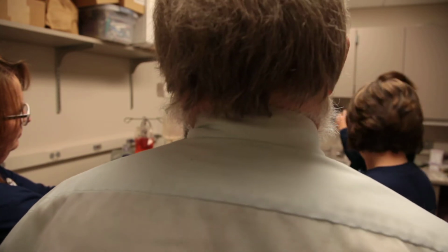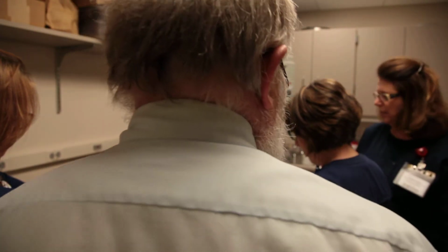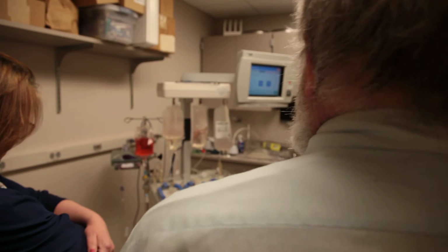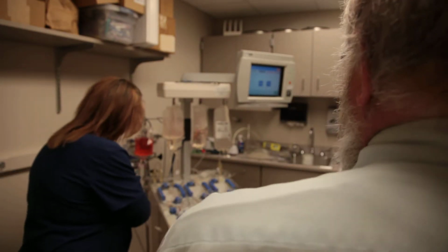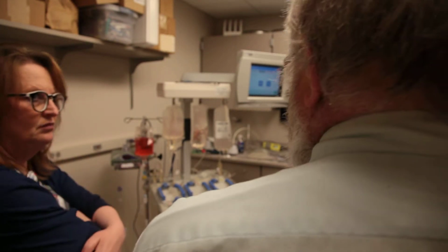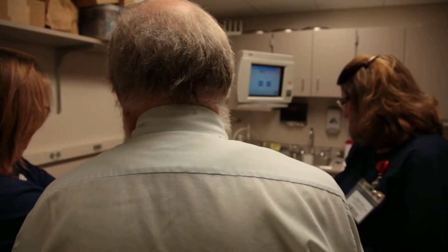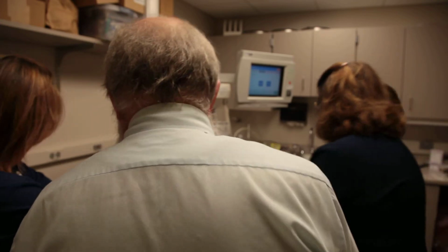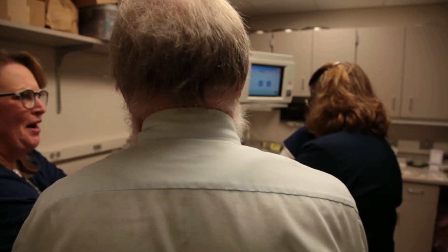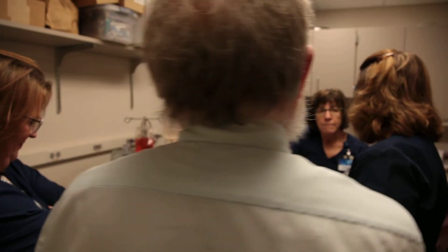Okay, so now you are ready to do your custom prime. You're gonna watch through, and the first 85 mils, once it runs the first 85 mils through there, it's gonna come up so you could stop the blood prime at any time. But we're not gonna stop, we're just gonna let it go, and it'll run until 200 mils. You wanna make sure that after the 200 mils, when it stops, you're happy that it's got all the blood into the bag. And then it'll stop automatically, and that's what we're gonna do.